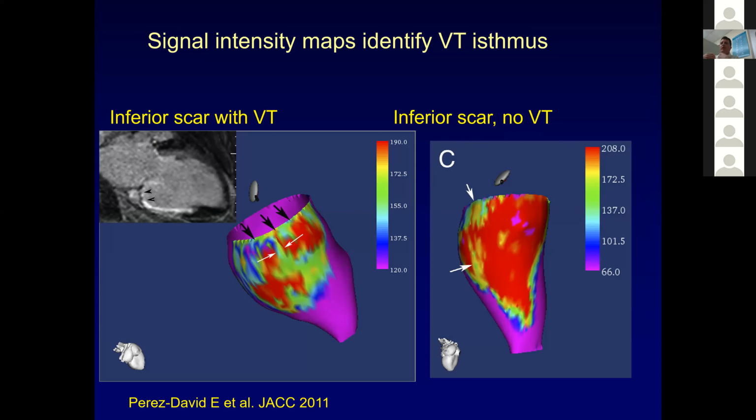And I think the overarching goal of all of us who ablate VT in centers like MUSC and Northwestern and Chicago is to make these procedures more accessible, not less accessible. And with MR, though this is very beautiful work, it's very difficult to do. And so it opens the question of whether or not CT imaging could be more helpful. We'll talk about that in a minute, but I want to drive home this point.